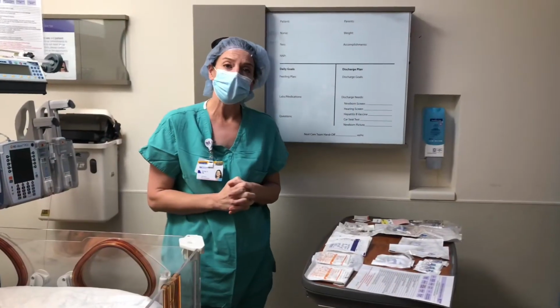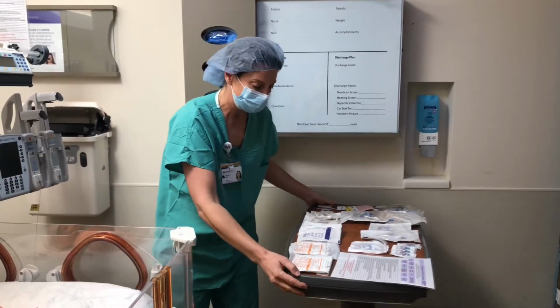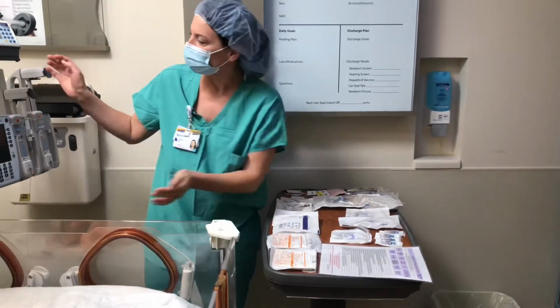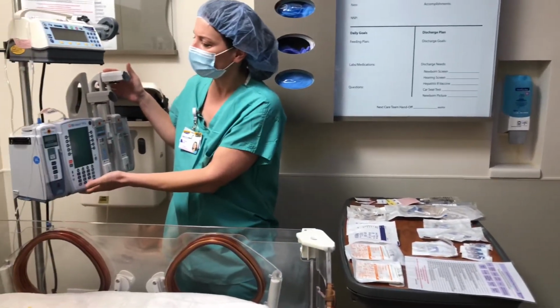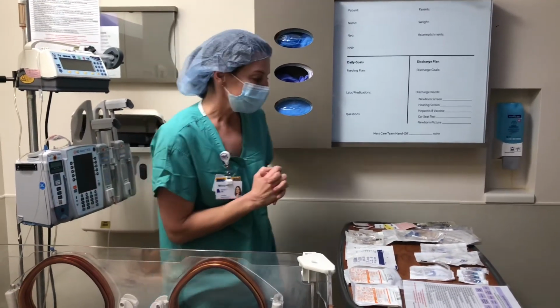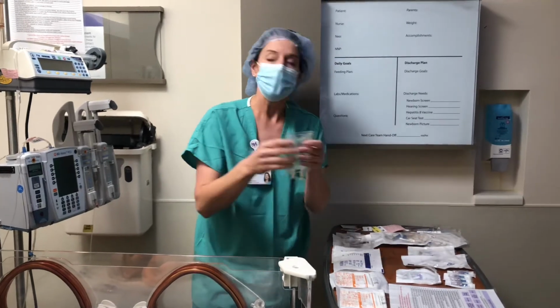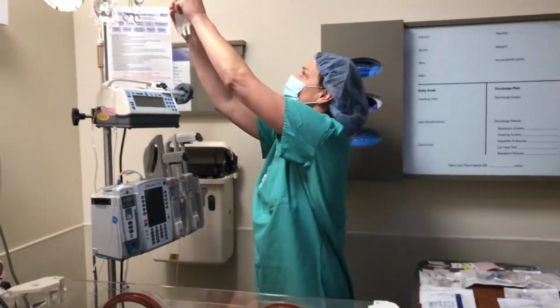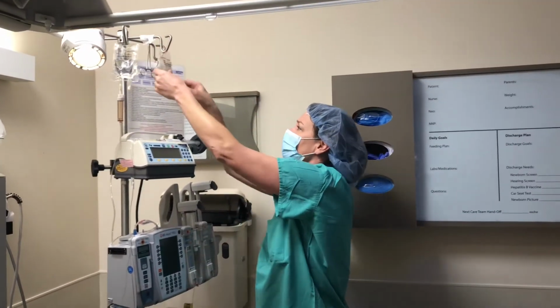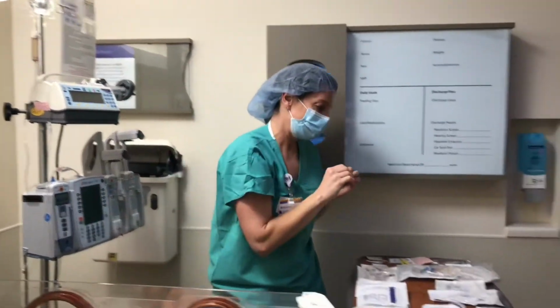Now that we have all our supplies, I'm going to move my table close to the bedside and kind of move my IV pump towards me, so that it'll make it easier when I'm changing my tubing. So to start, I'm first going to hang my IV fluid bag from the pharmacy. I'm going to go ahead and hang that, and I'm going to remove the cap.